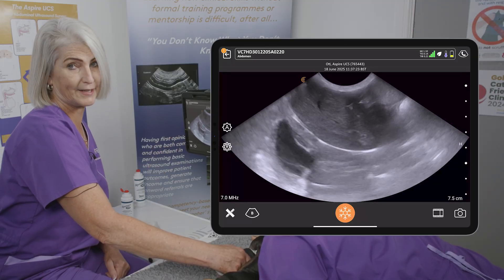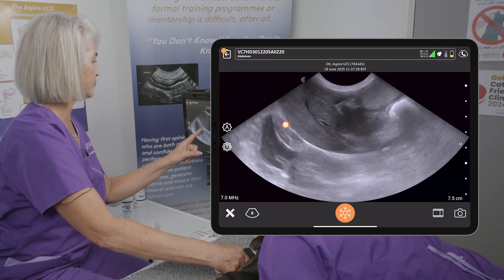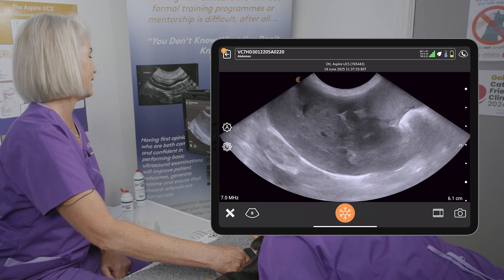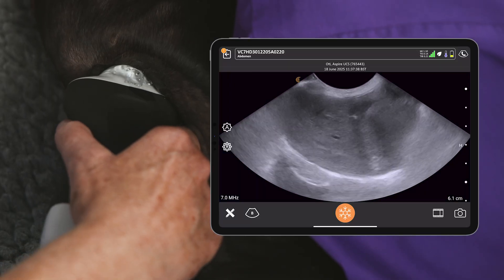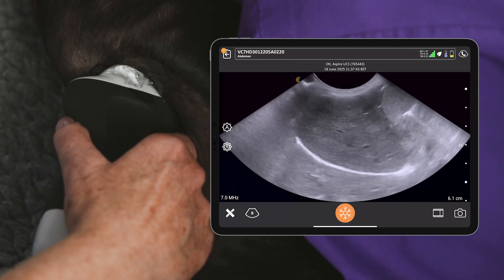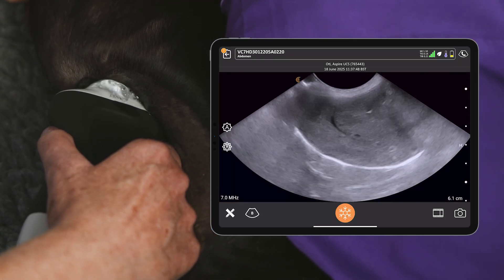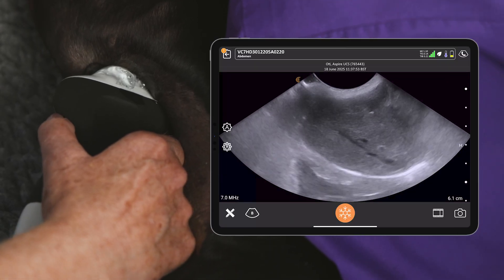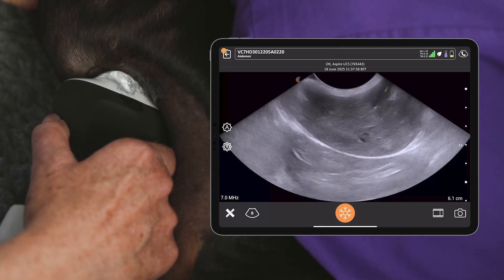We're going to concentrate on the liver now in long axis section. We want to make sure that our diaphragm — this bright curved surface — comes to the back of the screen so that we don't chop any liver off. Then we're going to angle upwards behind the breastbone to get the very cranial aspects of the liver. Lily's a small dog so we'll get the length of her liver in one sweep, but you may need to do this in strips almost like a hashtag pattern so that we don't miss any parts of the liver.